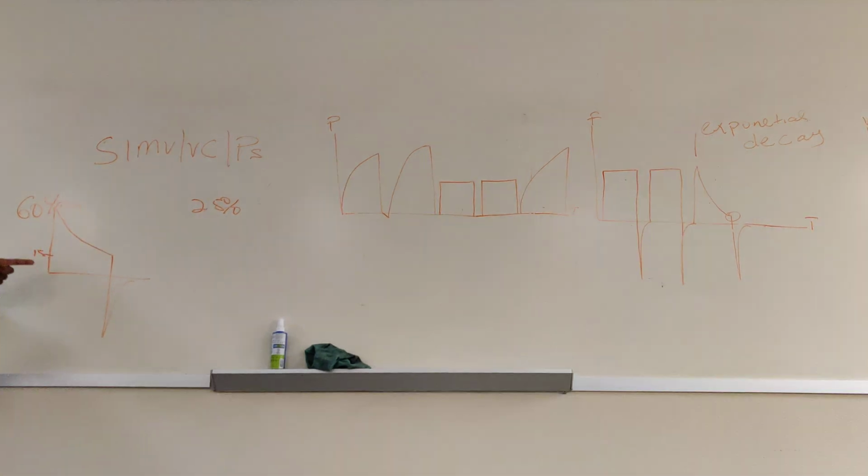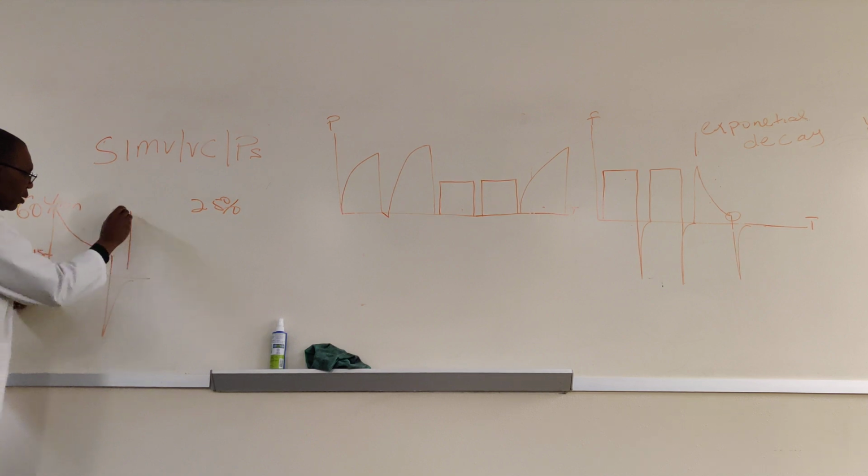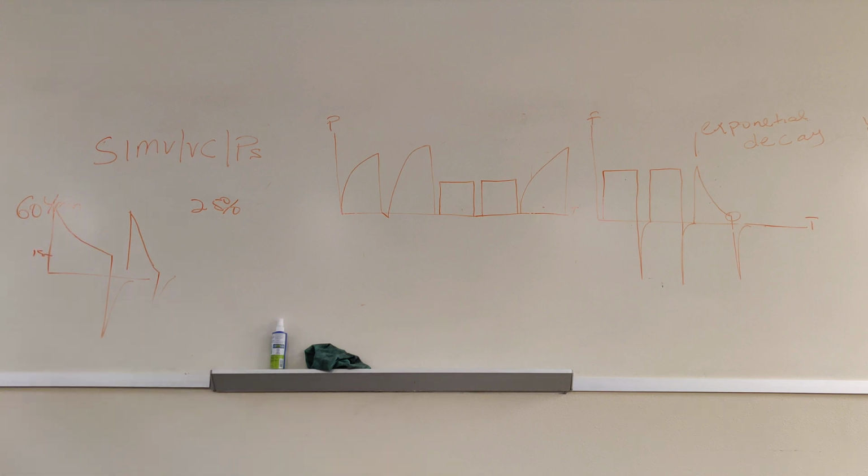If you set it to 30%, it means that it's going to drop down some more before the patient exhales out. Okay? So that expiratory sensitivity is used to cycle off spontaneous breaths. You gotta be careful setting that because the optimal setting is 25 to 30%.